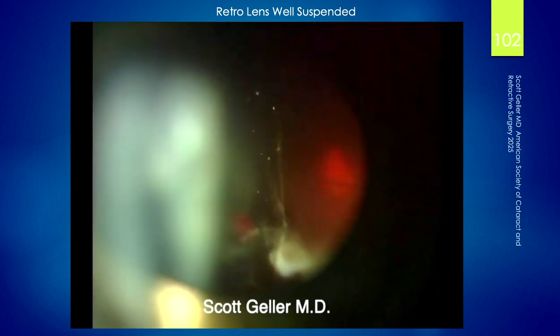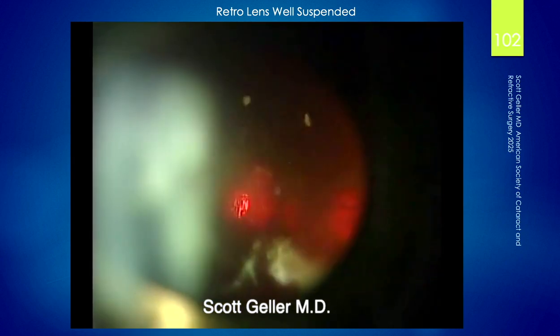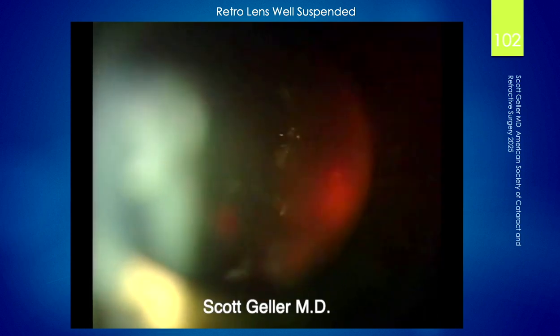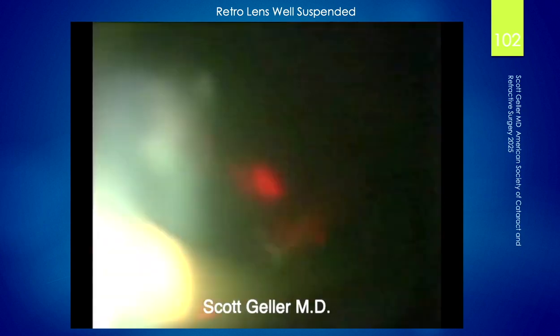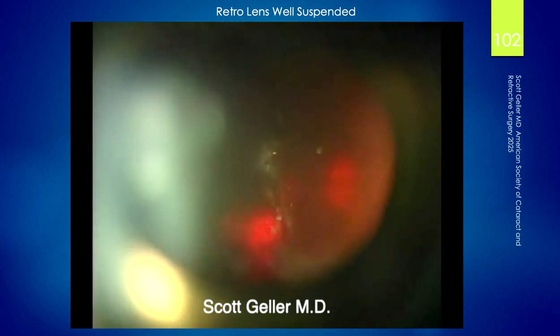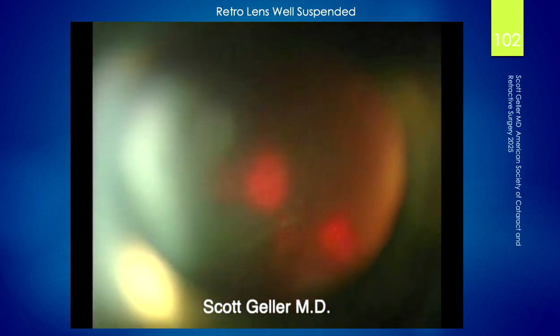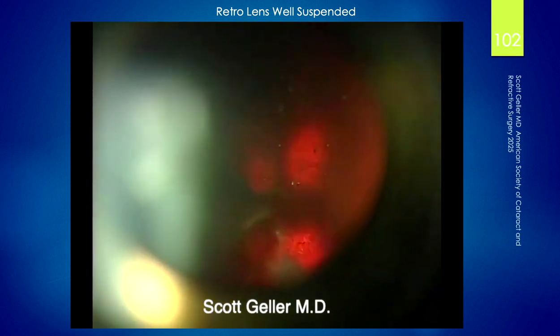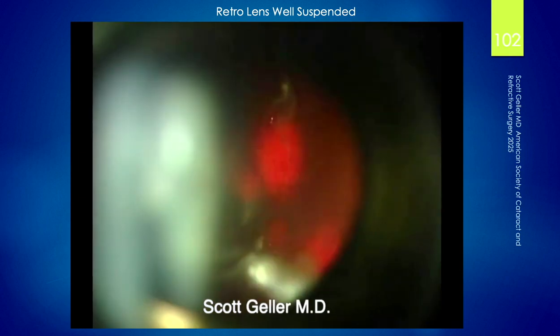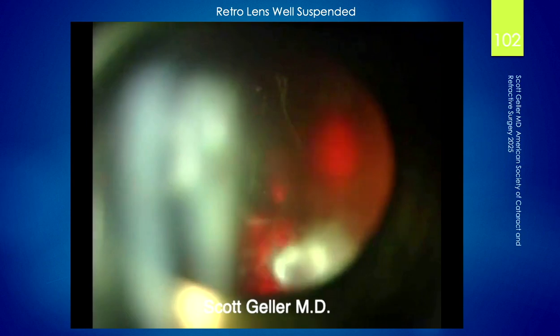Sometimes these cases take up to 4 sessions. I've done 4 sessions. I had one patient come in with a retro implant floater. I couldn't get anywhere with 3 sessions, and she said, I think I want to stop, because she already paid for my fee, which is not covered by Medicare, which included 4 sessions. And I begged her, I said, please let me go back in. I know I can do this. I told her I'm more than 50% positive I'll get a good result for you. She let me go back in, and sure enough, I got it out of her visual axis, and she was a happy patient.